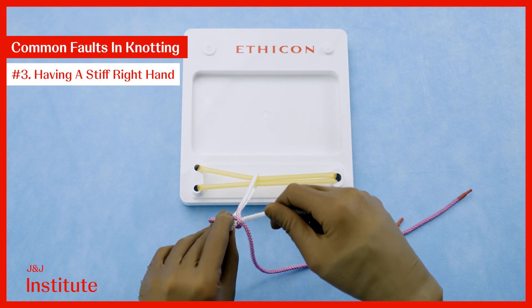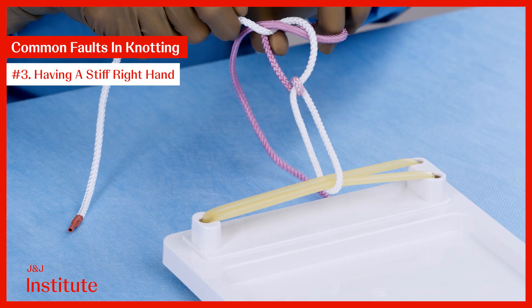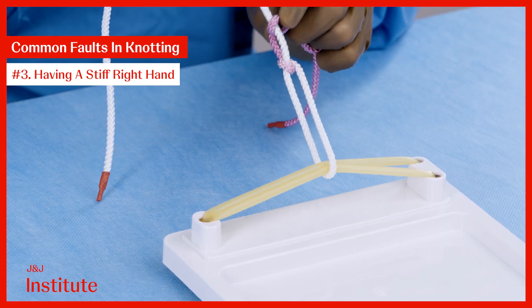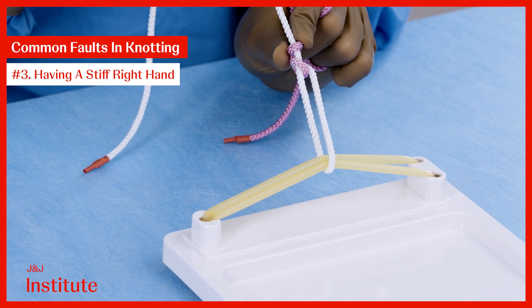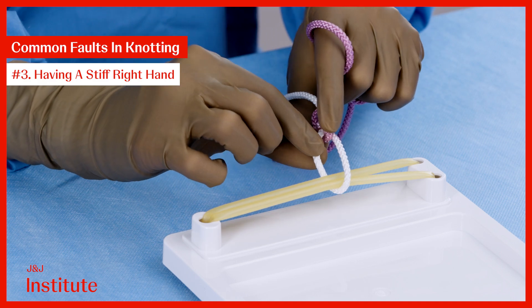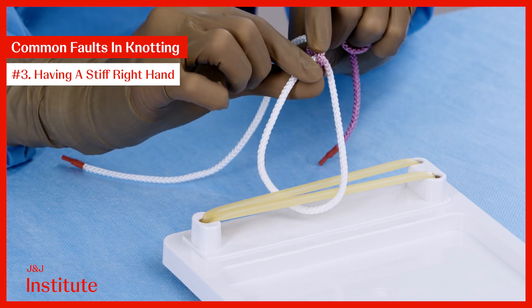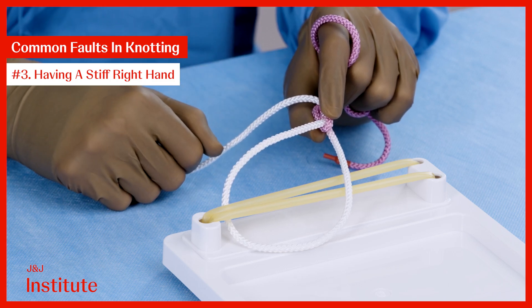Let me give you an example here. I perform a coming down throw and then a going up throw, but you can see the knot is actually formed around the white thread. This has led to the formation of a slip knot that goes down but is also unstable and can come undone. Remember to always cross your hands to prevent this.